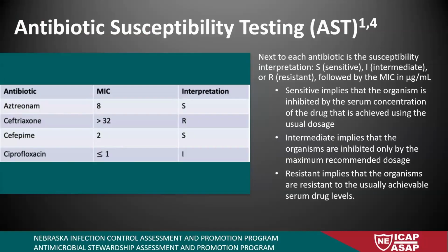And then some bacteria also have predictable susceptibility, so you're not going to see a susceptibility panel. An example would be group A strep. Group B strep, it'll say, susceptibilities to beta hemolytic streptococci are not routinely performed due to predictable susceptibility to penicillin. That's where your provider should know what the first line of treatment is, and you're not going to see a culture result because they don't particularly usually do cultures on that. So here are the different examples of those.